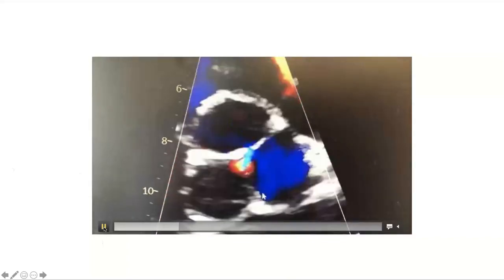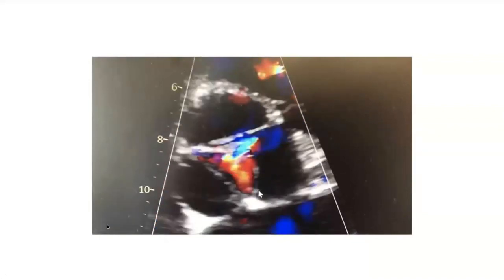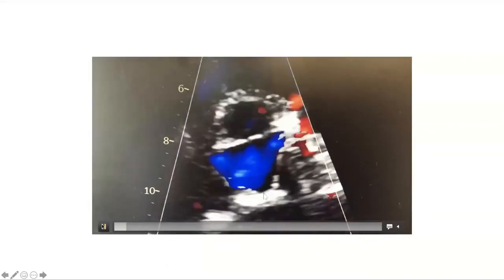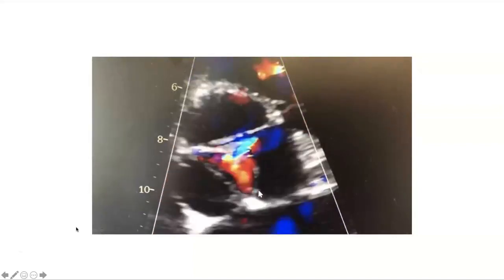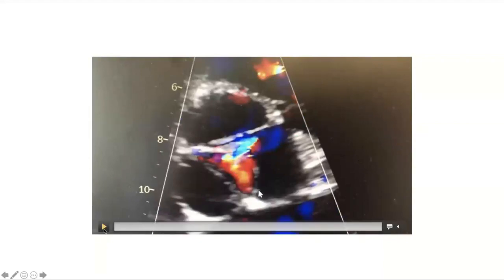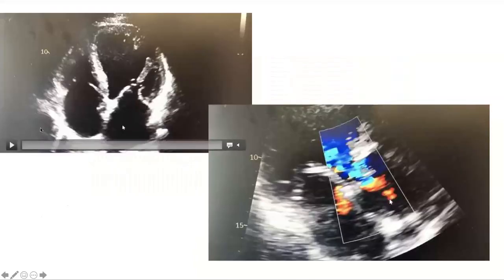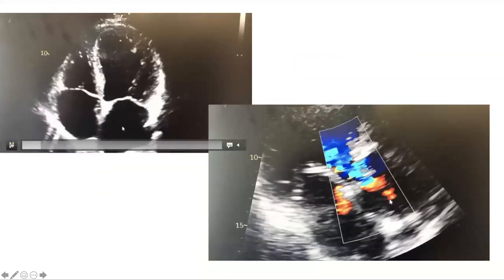There's the more anterior leaflet, which I think is the right coronary cusp, looks a little bright and slightly thick, but I think I'm overcalling that a little bit, to be honest. There's not a ton of chunky calcification or abnormality associated with this valve, but we do see that there's a large central regurgitant jet that we can appreciate on this image. Yeah, absolutely. We keep going down, just a couple more.